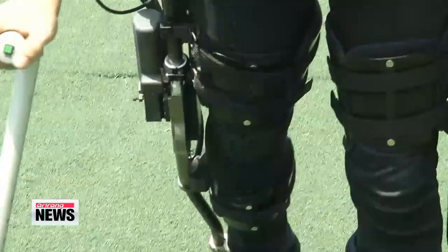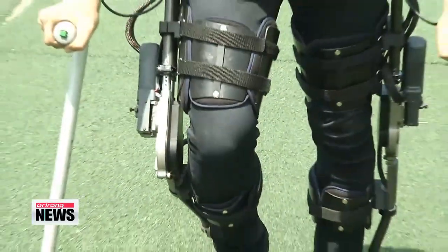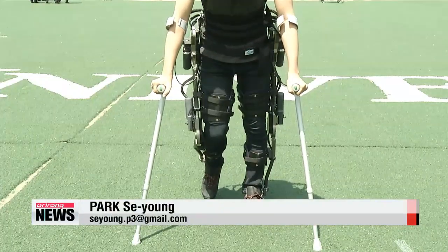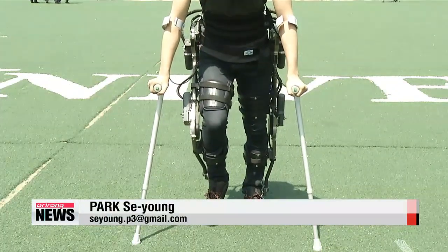The robot's walking function may even be able to help patients suffering from complete paralysis. Its motors can generate movement from scratch, and because of its many sensors, those movements look natural.